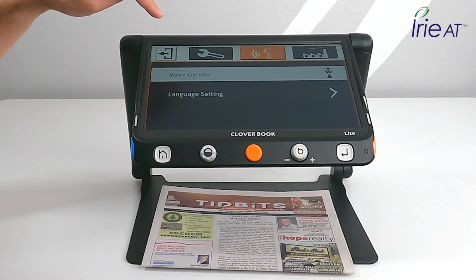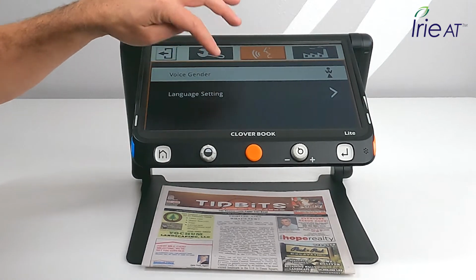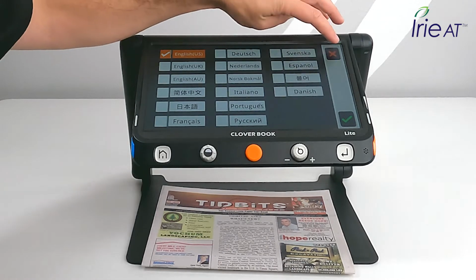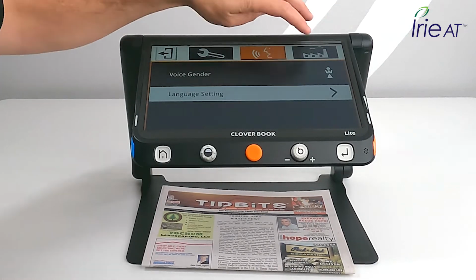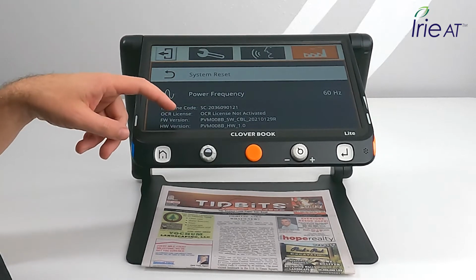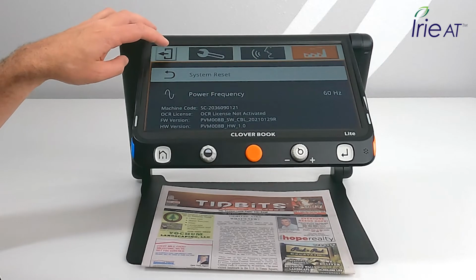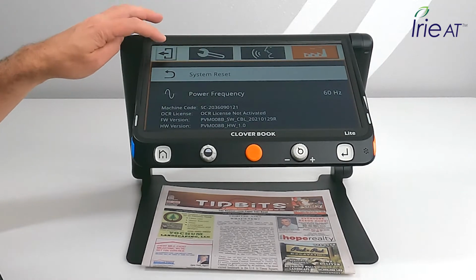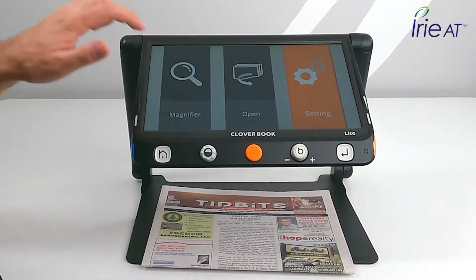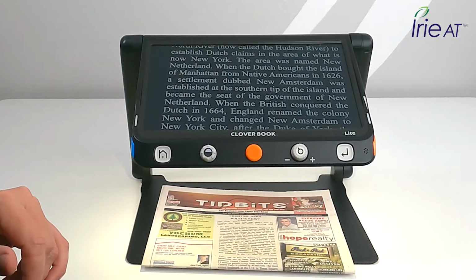Then you have different voice settings. You can have female or male. You have a number of different languages to choose from. And you just choose that if you want to choose a different language. And then you have system reset and some other options in here that you hopefully don't want to touch too often. But if you did have a problem, you could just hit reset and reset the entire device back to default. So that is the settings and the menus.